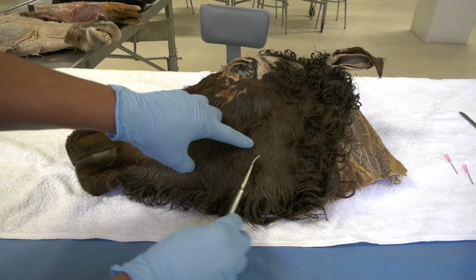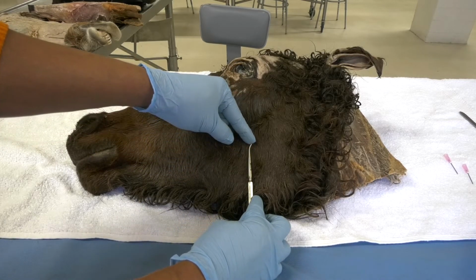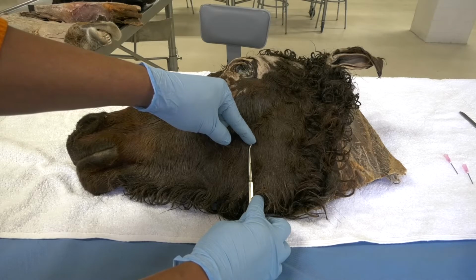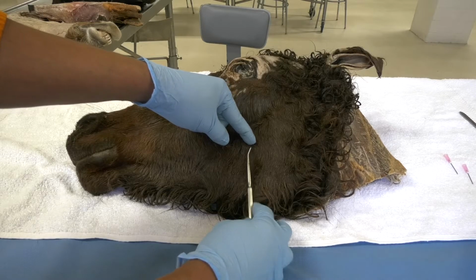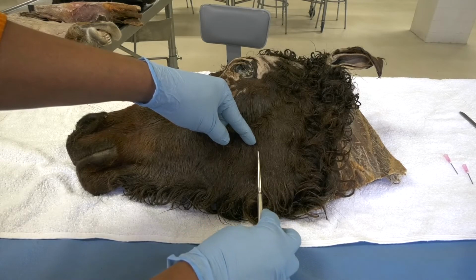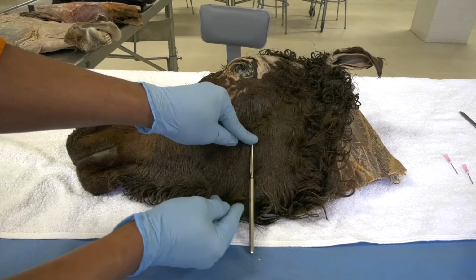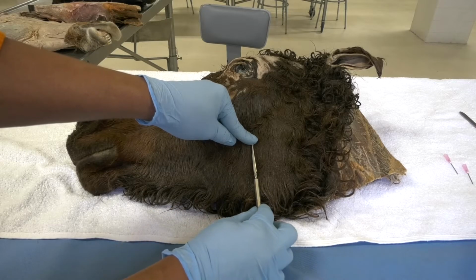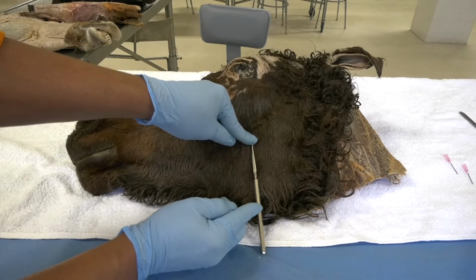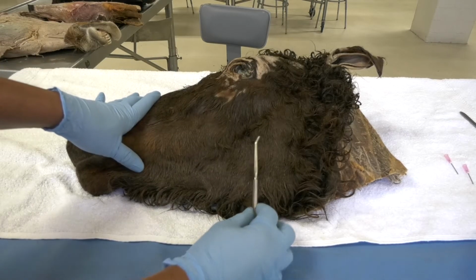So you measure the distance from here up to here, and this will give you the size and the length of the needle that you need to use. You insert the needle from the medial aspect, and usually you mark your needle, so you know where to stop when you are inserting your needle, and once you reach that mark, you stop and you dispense your anesthetic agent.